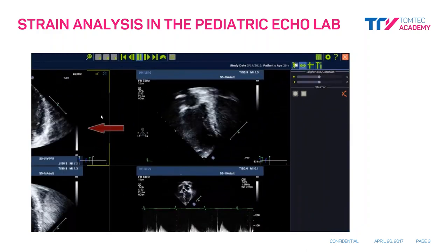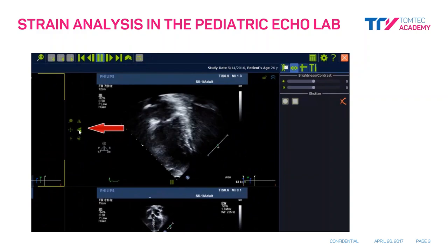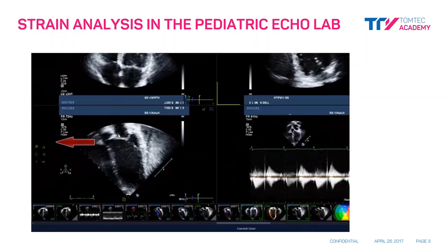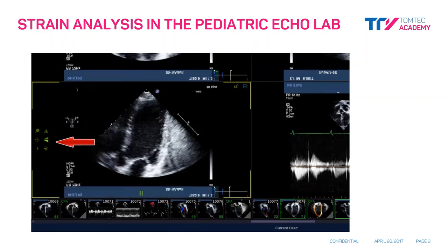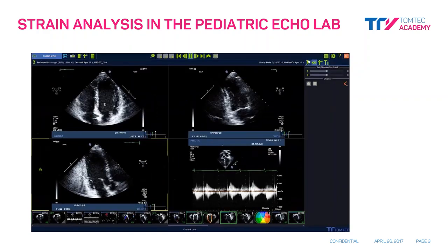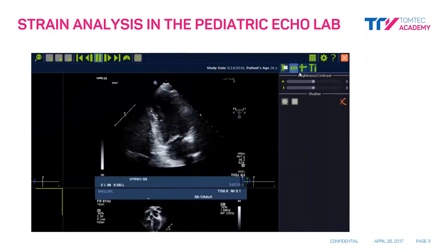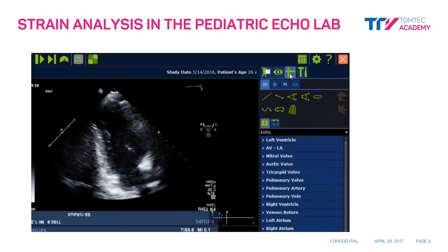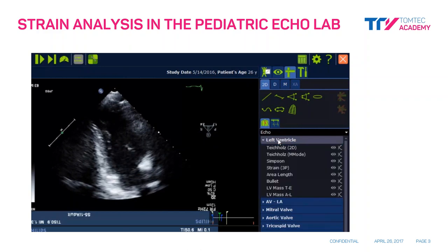Next, we will do the same for the apical two and three chamber views; however, for these views we will not only flip up and down, but also left and right for proper segmental orientation. Once completed, we can proceed to the measurement package located in the upper right hand corner. Select the left ventricle option and then select the strain three plane option.